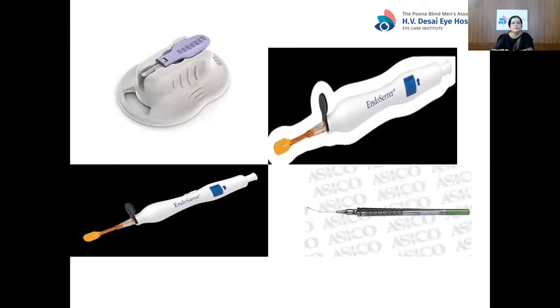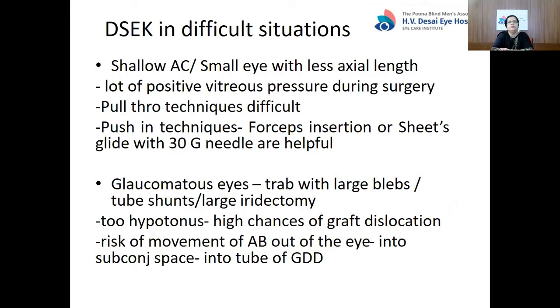Difficult situations include shallow AC or small eyes — especially Asian or Indian eyes with less axial length — which present a difficult situation because of positive vitreous pressure during surgery, making the pull-through technique difficult. As a contingency technique, the push-in technique, forceps insertion, or sheet glide insertion with a 30-gauge needle is helpful in these situations.